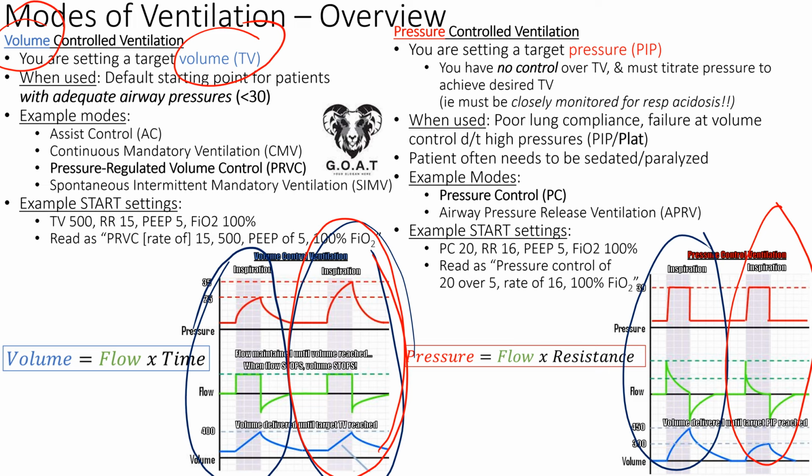So how do you know it's high for them? Based on their ideal tidal volume, right? Which is your 6 to 8 mLs per kilo of their ideal body weight, right? Based on their height and birth gender, that's going to tell you if that tidal volume is good for them or not, right? So 6 to 8 is usually where everybody starts, right? So 6 to 8 per kilo is what we're starting these guys at.